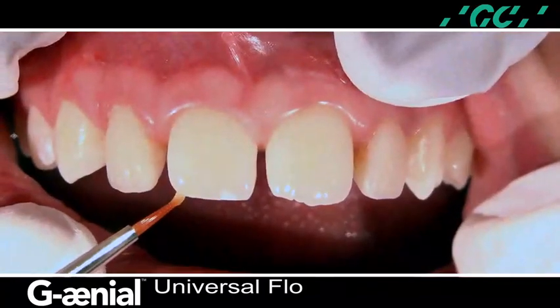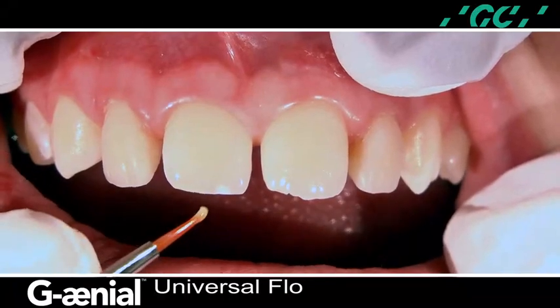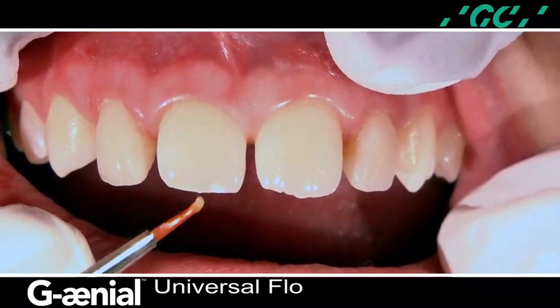Notice the stability of the material on the brush tip. This characteristic allows precise placement. And light cure the material for 40 seconds.